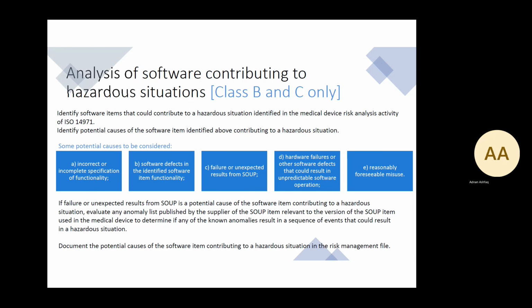What I often try to discuss with clients is to make sure that you have some kind of use flow, process flow chart, which has all of the step-by-step stages of how the user would use the software. From the moment the machine is started, you're logging on to some system with user credentials, password, and then following on from there, what would be the sequence of events?